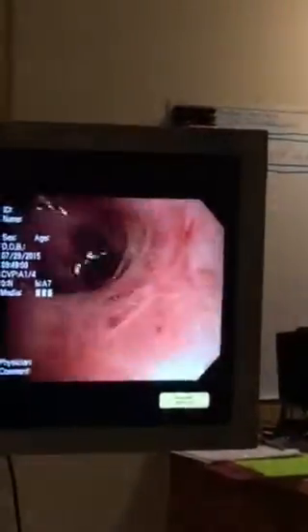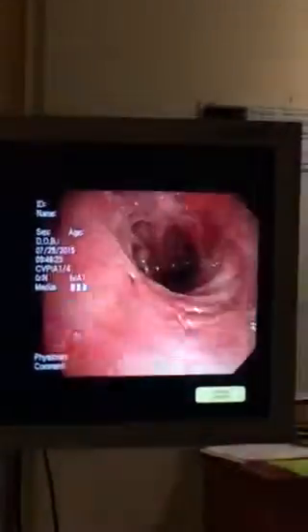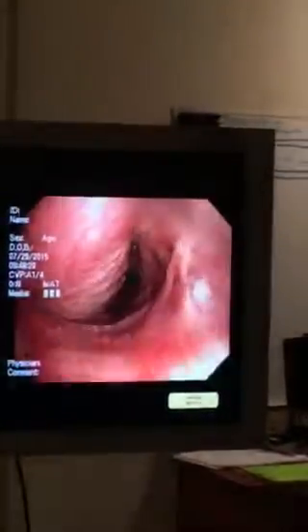But you see how raw those airways are. This is what bothers her. And if you try to cough that stuff up, it just gets caught in all these little traps. You see all that? Imagine if you were trying to walk across a field and you had to walk across all those holes and ridges, it would take you forever. It's the same with the mucus trying to come out. It gets caught and all that stuff, and she can cough until she's blue in the face and still can't get it all out. Alright, more saline now.